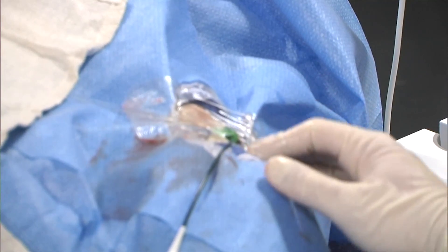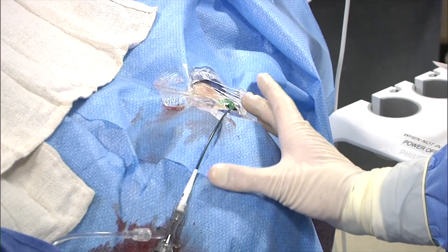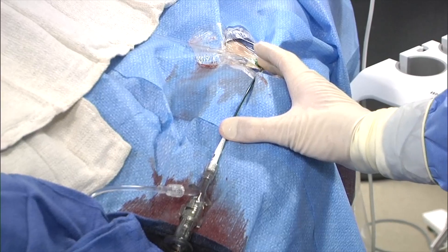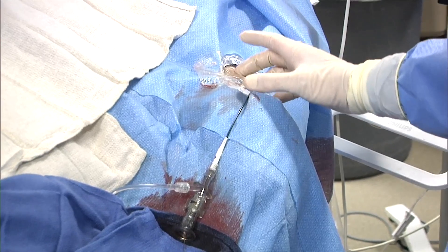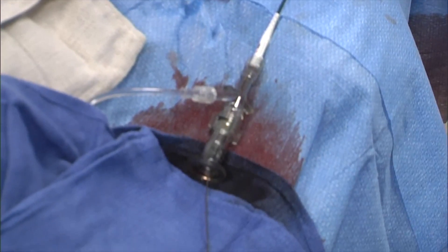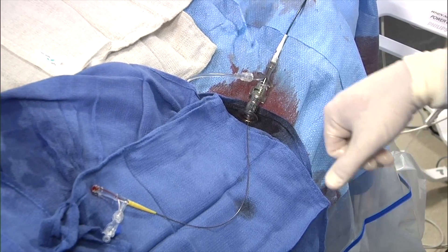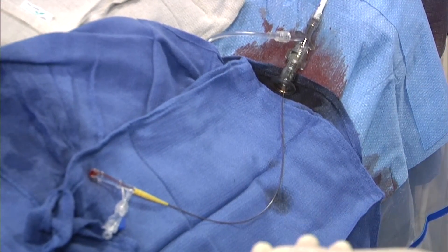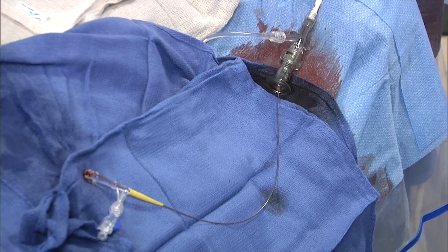We went down, and I'll show you those images in a second. We put down this — a 6 French 070 guiding catheter, 100 centimeters long. This is called the Concierge Ultimate Shape by Merritt. 100 centimeters is a good length in smaller patients. Here's our Guardian device, and through here we have our 150 Scepter C microcatheter. This is a MicroVention catheter made for neuro application, but it's a balloon tip microcatheter, which is a pretty interesting concept not only for this type of case but also for liver-directed therapy.